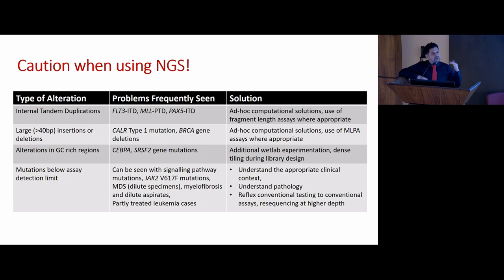Always for an MPN patient, run a real-time PCR assay on the side. So understand the clinical context. If an MDS patient is there and the sample given to you is extremely dilute, some genius sent peripheral blood for MDS and NGS because he forgot to send a bone marrow sample when it was being drawn.